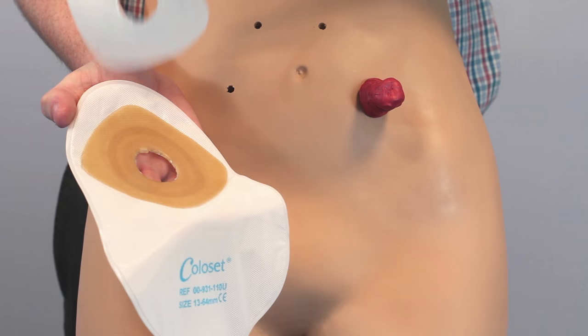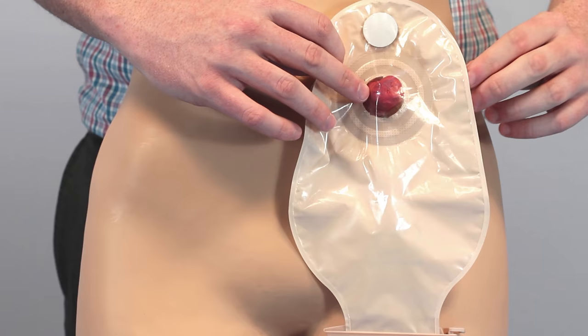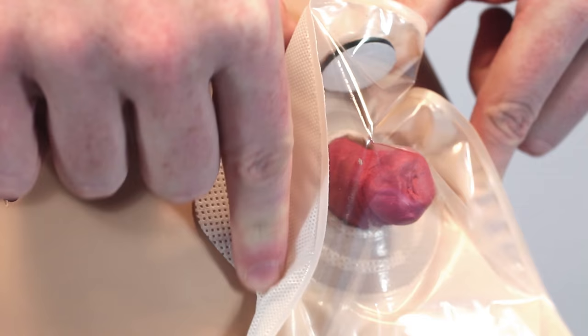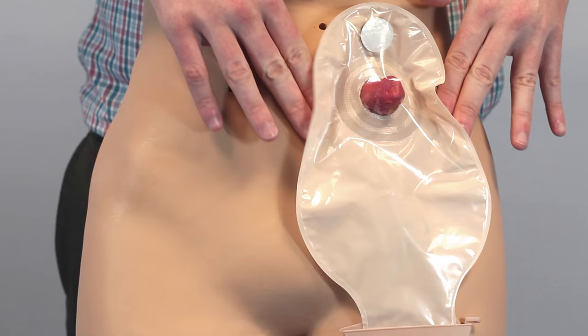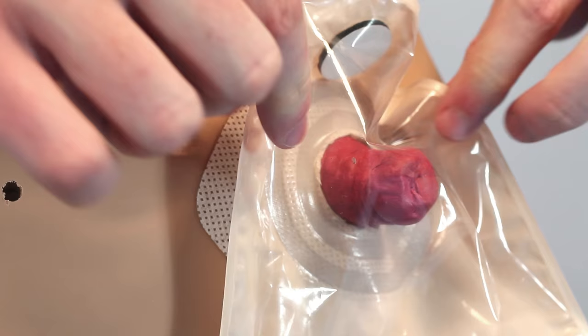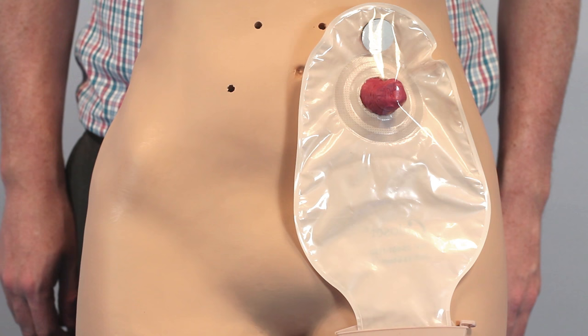Turn the pouch around, being careful not to touch the adhesive parts of the barrier. Place the barrier directly over the stoma and seal the barrier from the inside out. Smooth the pouch to maintain a slim profile, and that's it.